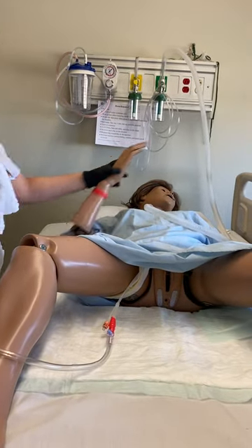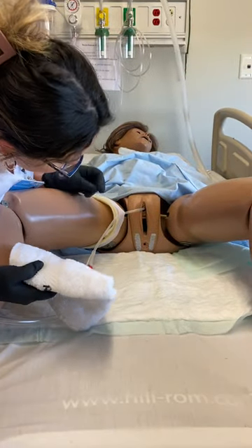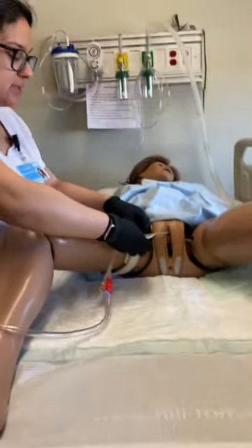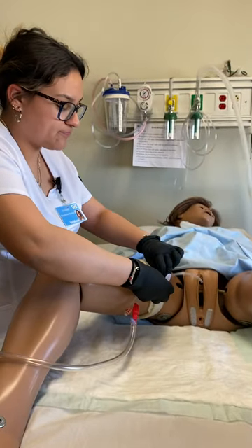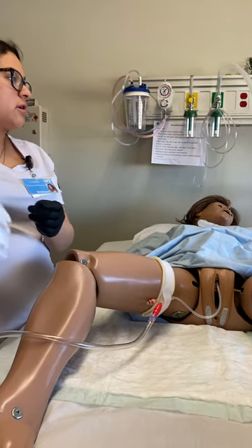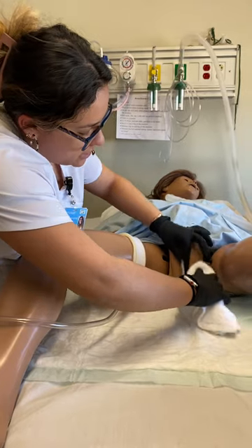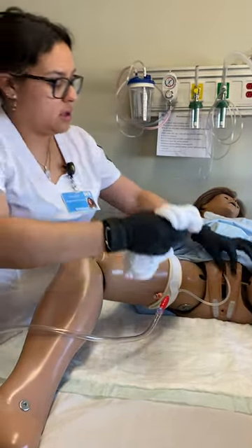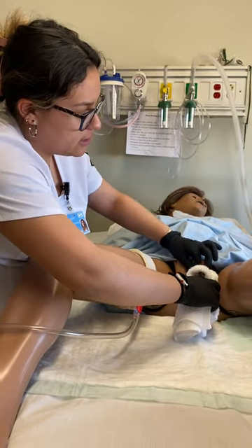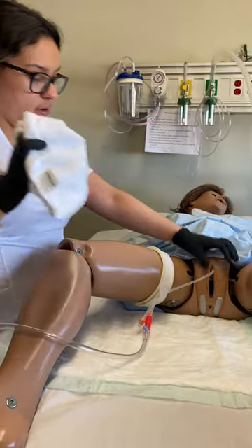There we go. Looks like we have a little bit of something over here. I'll have you lay your hand right there on your abdomen. I'm going to go ahead and observe the area, making sure that everything's still intact. I'm going to go ahead and perform cath care first, using the cath care specialized wipes. I'm going to clean right over here, open, pinch the cath, clean over here, open, pinch the cath, clean down here, pinch over at the cath section, and clean all the way down. We have done cath care.